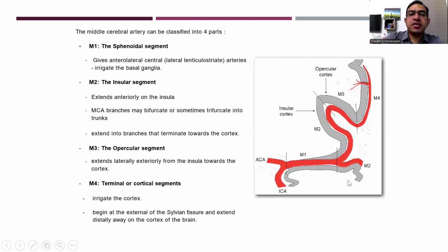So it is important that you identify the flow of blood at a region where there is no branching of the blood vessel, and there's at least a 2 centimeter persistent unidirectional flow of blood in the blood vessel.